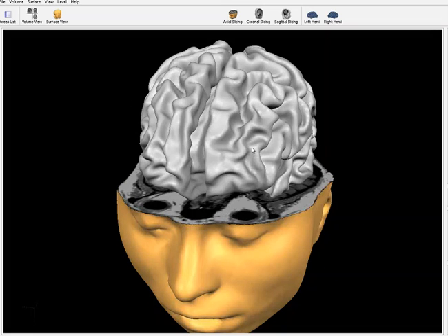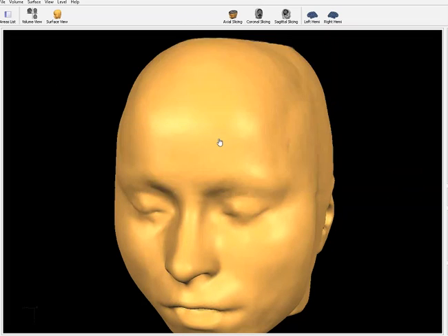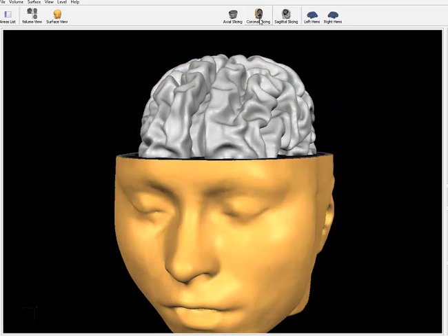These views are completely unavailable today in the Key Institute's Loretta. With these new tools, you can use segmentation, which was not possible with the Key Institute. You can isolate just the white matter and also have projections of the sources onto the scalp surface, so you can relate the electrical currents at the scalp surface to the actual connectivity of the white matter.